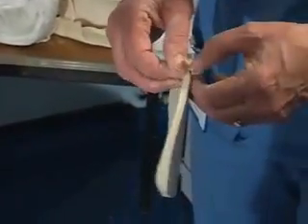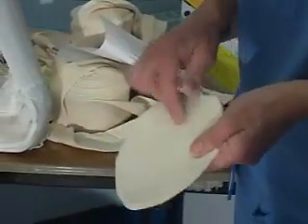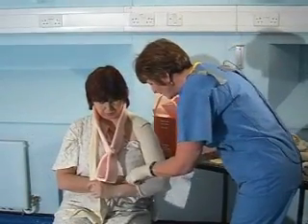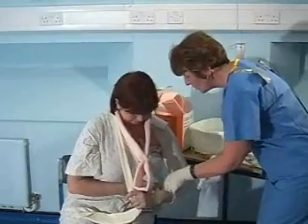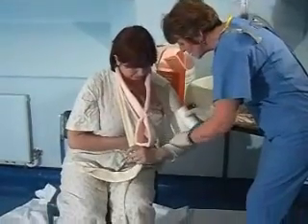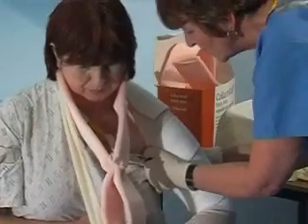It's got a sticky bit on the back which you peel off. Make sure this sticky doesn't go onto the skin — your stockinette would be wide and then stuck on. If you're bony around the elbow you can also put some small bits of felt around the elbow. The patient is going to abduct her arm a little bit — if she comes over the side she can do that with not too much pain. I'm making sure I don't get any creases in the stockinette as I go down, half to three-quarter overlapping, which should be done in any cast wool under-cast padding.